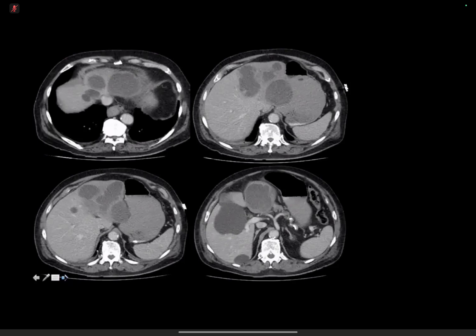I'm not quite sure whether this is within the mesentery or perhaps related to the pancreas or small bowel or another nearby structure. I'd have to look above and below and evaluate that. But looking at the multiple liver lesions themselves, if they're not cysts, and I don't think they're simple cysts, the walls look slightly irregular and there's some minimal enhancement. My differential for these is between either cystic metastases from malignancy or abscess.